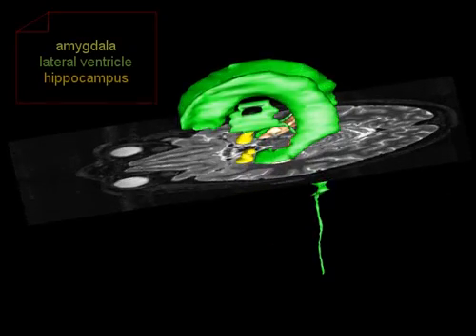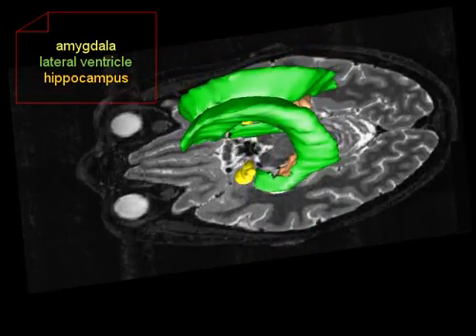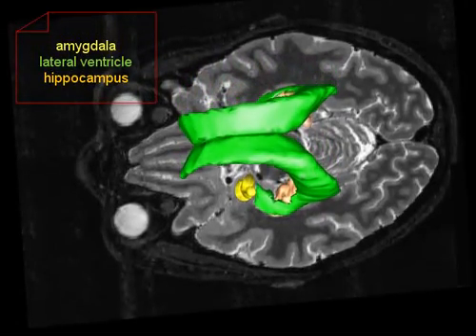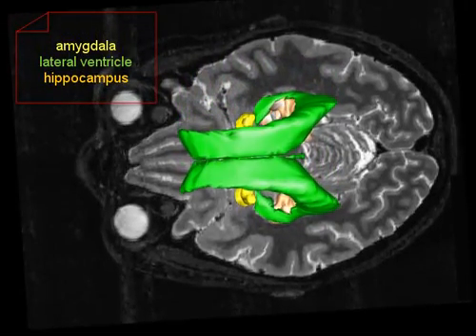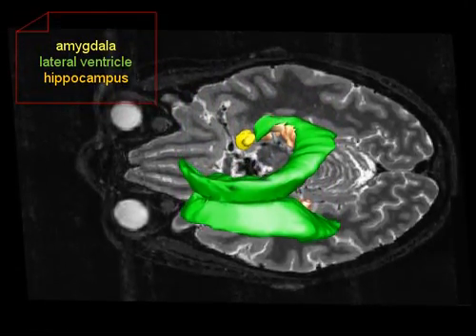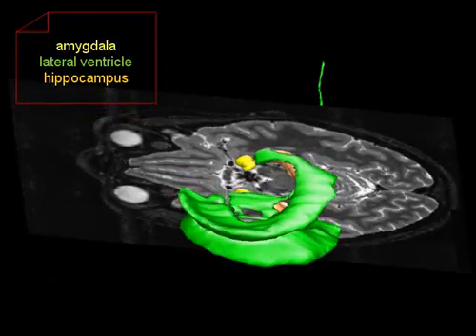Here is the lateral ventricle, shown in green. The lateral ventricle separates the amygdala and the hippocampus. All three structures have been reconstructed and placed in a T2-weighted MRI.